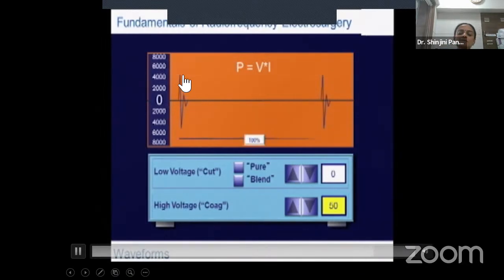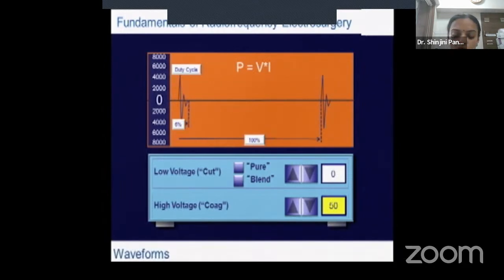Now, therefore, please remember that whenever you are pressing the blue pedal on your monopolar pencil, you are sparking and raising the voltage to thousands of volts. Sometimes this current can be very hazardous because it acts like lightning. Lightning comes from the sky and crosses the air, which is the highest resistance tissue, just because it has very, very high voltage and can cause tremendous damage.